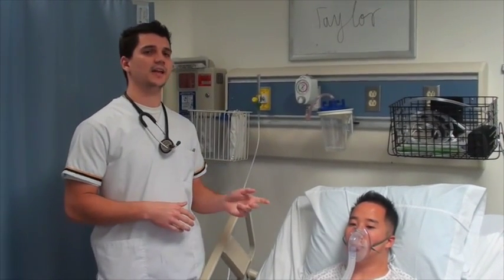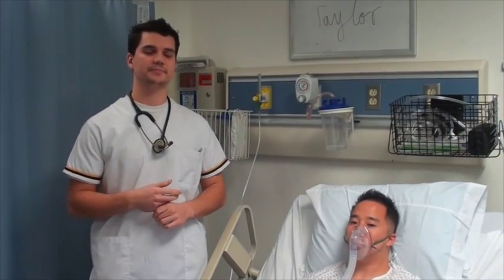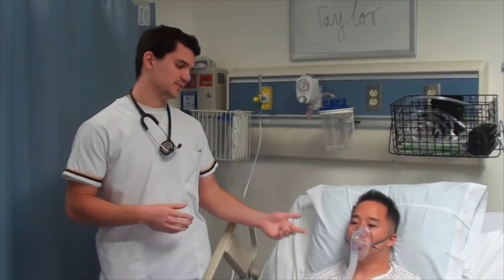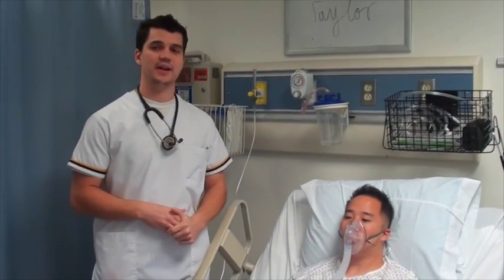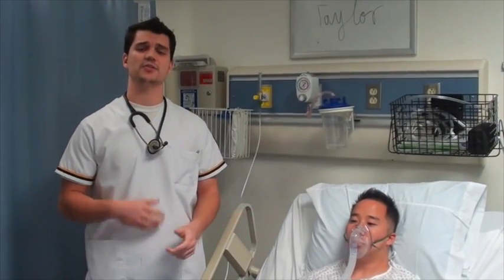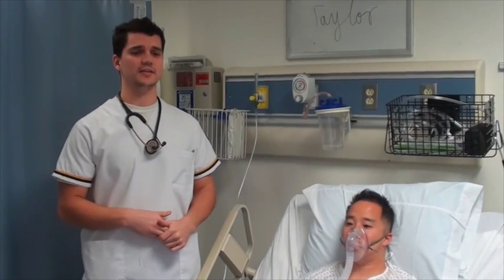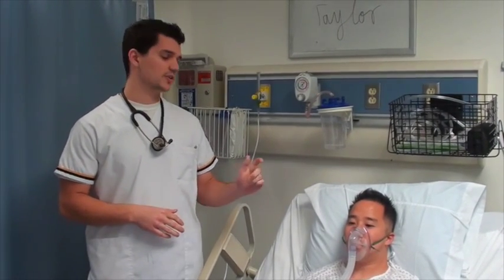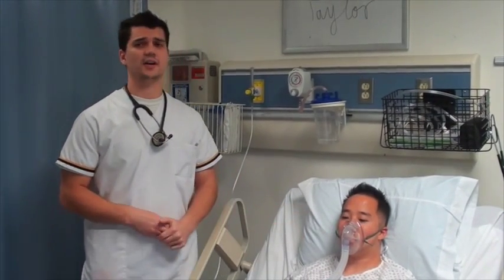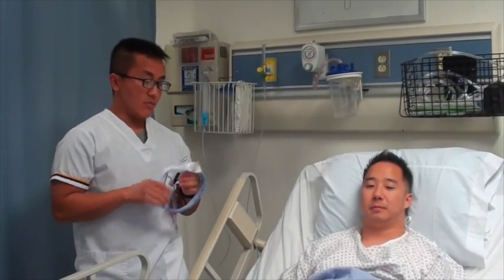And it's also indicated for patients who have carbon dioxide retention. Some nursing considerations: like other masks, you're supposed to clean it and remove it every 2 hours. Also, it's uncomfortable for the patient, so when the patient is eating, make sure you take it off and put a nasal cannula on instead. Also, you're going to want to watch the pressure around the ears. During prolonged usage, it can cause necrosis. And that is the Venturi mask.